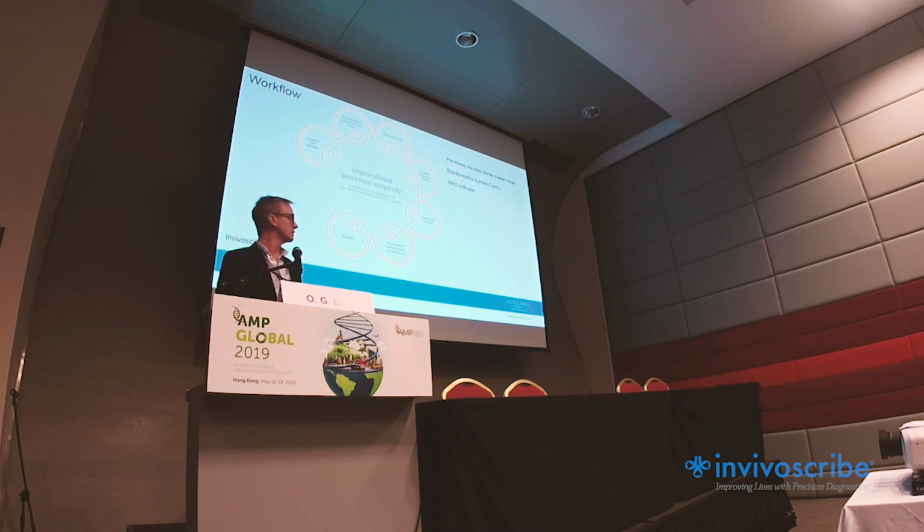This schematic, just taken from the Invivoscribe website, I included just to highlight the workflow involved in all these kits that we've used. It really is a very simple process right from the start, where you prepare the DNA, the primers are all pre-mixed, one-step master mixes, and everything from start to finish is included in the LymphoTrack kit. So the bioinformatics, I'll show some data from, and also the MRD software.